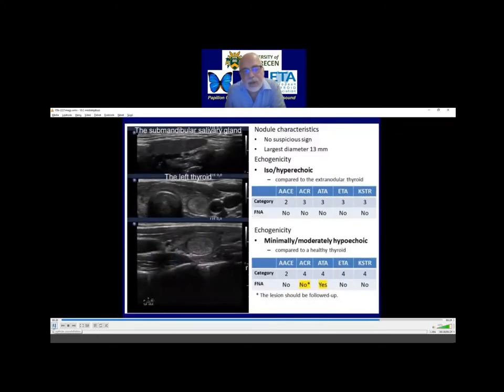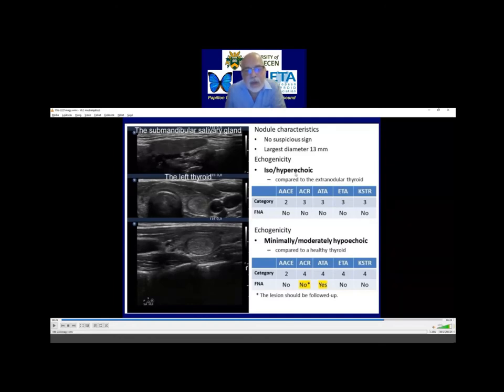If we compare this nodule to the extra-nodular parenchyma, as was already presented in the brief summary, it is clearly lighter than the extra-nodular parenchyma. So if our reference tissue for normal thyroid is the extra-nodular parenchyma, then the nodule should be considered as iso-hyperechoic, and no guidelines would suggest fine needle aspiration cytology. But if the reference tissue is a healthy thyroid, then this nodule would be minimally to moderately hypoechoic, and two of the guidelines would give the patient a chance to recognize their malignant cancer.